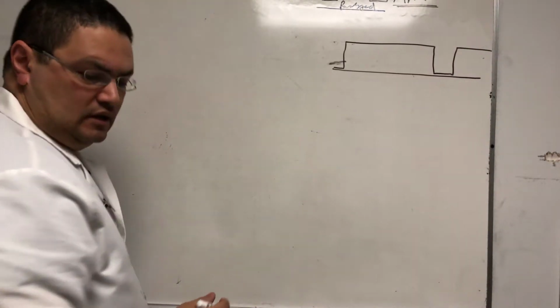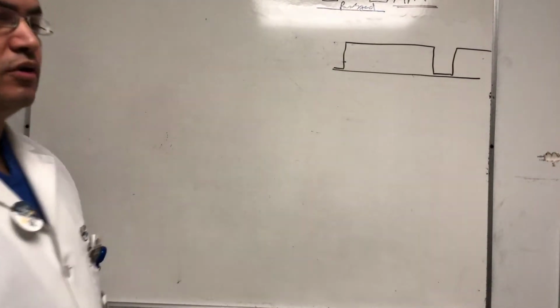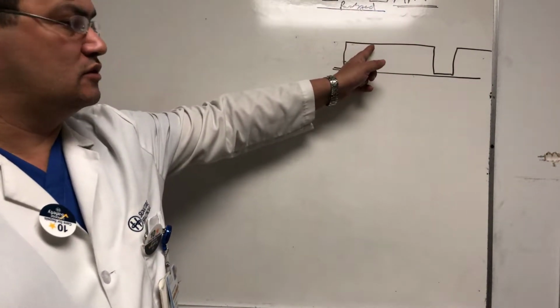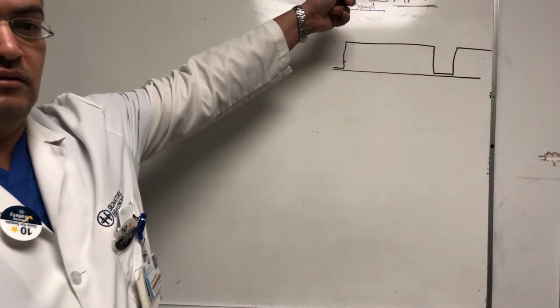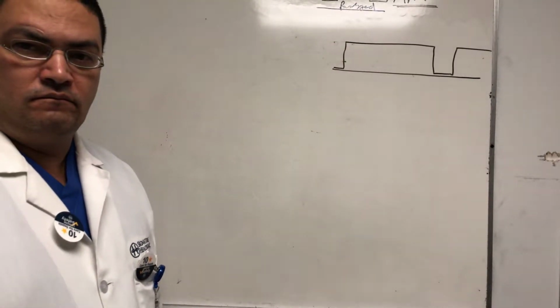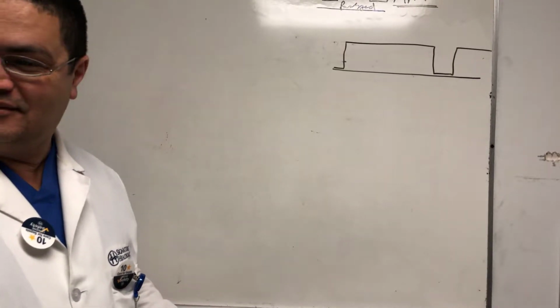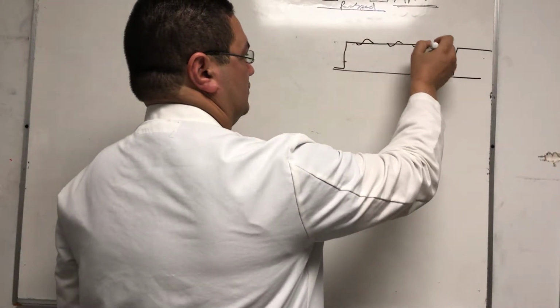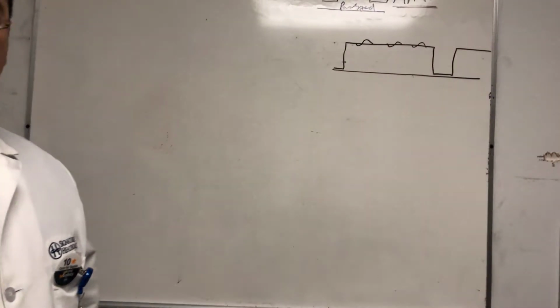Right? So basically, you can see from here, it's actually much longer compared to this. But the patient tolerates this without paralysis and doesn't tolerate this without paralysis. Why? Because they can breathe on top of it. Here, they can't. So if I'm holding them for 2 seconds in pressure control, they can't do anything.